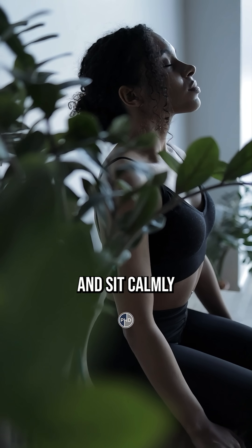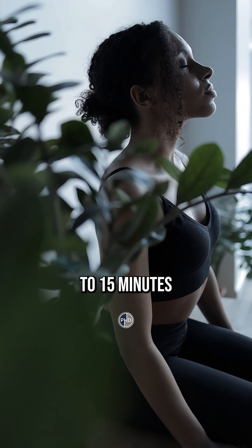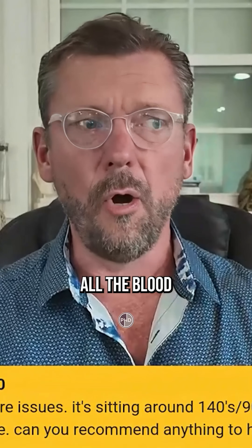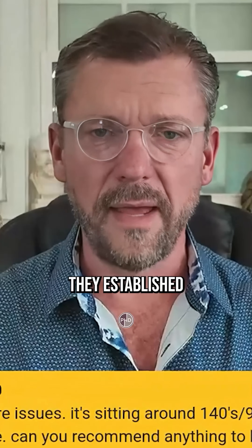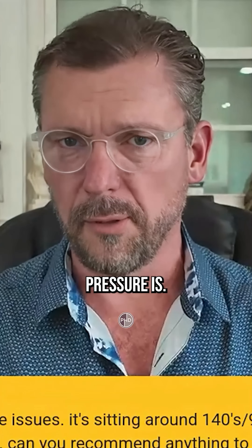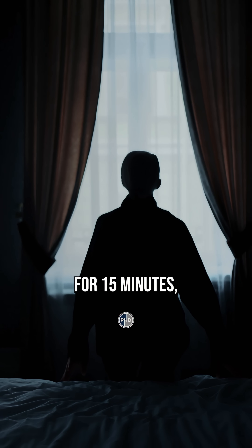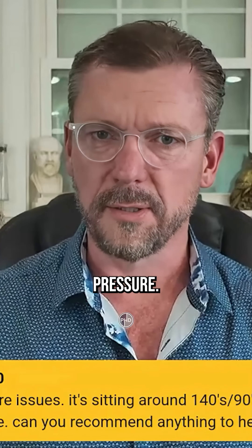Take a deep breath and sit calmly for 10 to 15 minutes before you check your blood pressure. All the blood pressure research that established what a normal blood pressure is — they would put people in a dark room, sit there for 15 minutes calm and relaxed, then check their blood pressure.